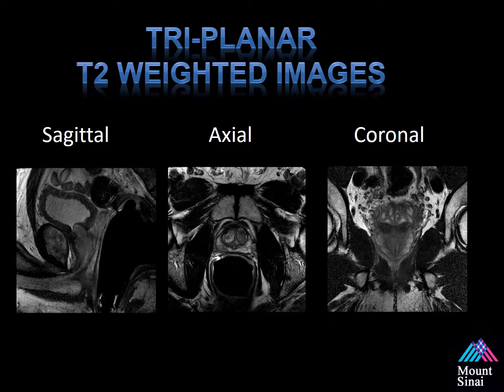This is an example of the anatomical sequence — sagittal, axial, and coronal reconstructions of the T2-weighted images. Each one of these sequences is obtained independently. We find it helpful when a lesion is present in both sequences, as it really increases confidence in calling it a lesion. We typically like to look at multiplanar T2-weighted images during our diagnostic process.